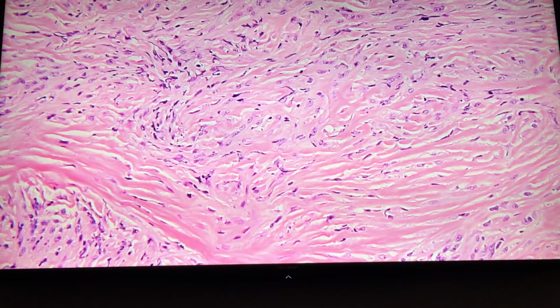But those things can be very difficult to tell. I mean, it takes a lot of experience to diagnose this in the absence of a malignant epithelioid component next to it. All right? So this is a biphasic mesothelioma with a desmoplastic component. So if you only had this, would you only do cytokeratin or D2-40?